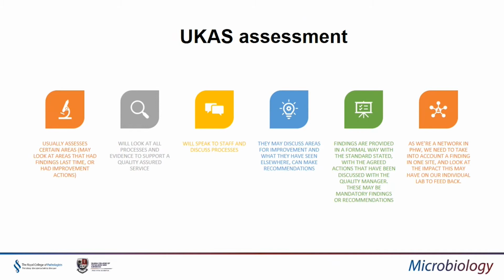Findings are provided in a formal way, with the standards stated and the agreed actions that have been discussed with the quality manager. So these may be mandatory findings or recommendations. And as we're a network in Public Health Wales, we need to take into account all of the findings for every site. So it might be a finding that's in one other lab that's not in ours, but we need to look at: do we have the same problem? And what's the impact of this on our individual labs so we can feed back, because we all work to the same standards.